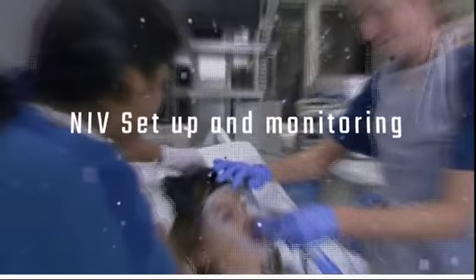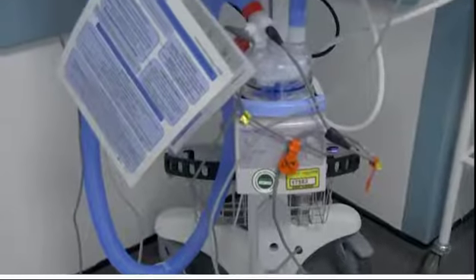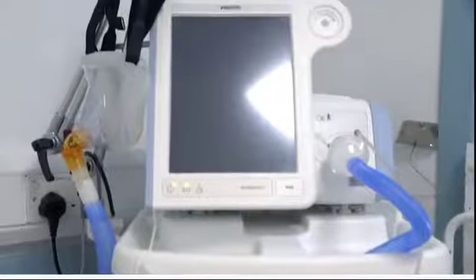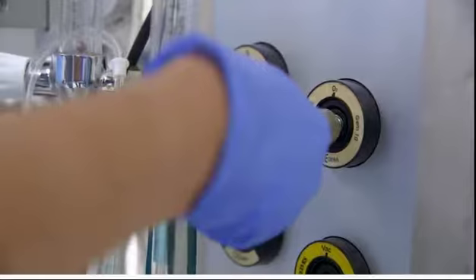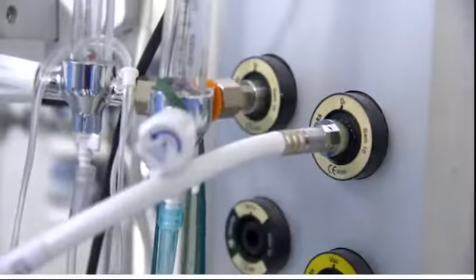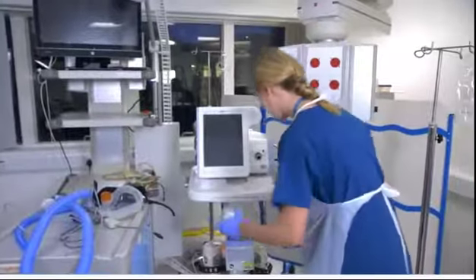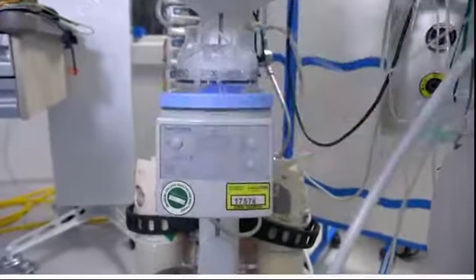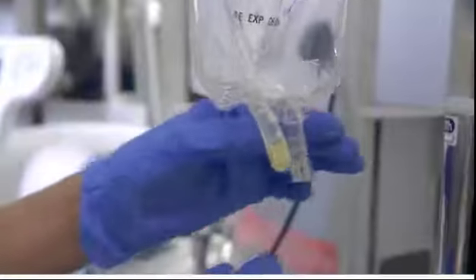NIV should be set up by a competent practitioner. Before setting up, ensure all equipment is available, including a humidified circuit, different size masks, and a humidifier box. Plug the V60 in and connect to the wall oxygen. Connect the circuit with pressure line to the ventilator, ensuring there is a bacterial filter within the circuit. This is the humidification box. Attach the water chamber to the heating plate, then attach to a bag of sterile water.